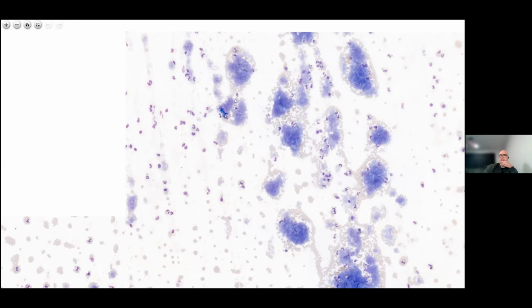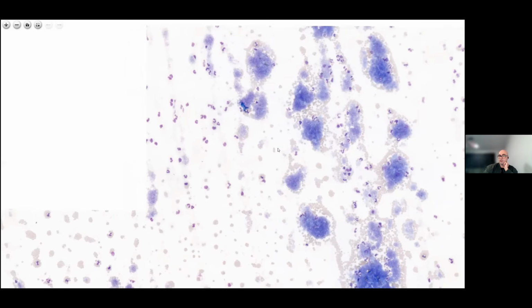I would highly recommend that for how you action and troubleshoot these, you follow your standard operating procedures or your procedure manuals for your laboratory, because how to troubleshoot platelet clumping varies wildly from laboratory to laboratory. We see this on the hematology interest group when people discuss it.